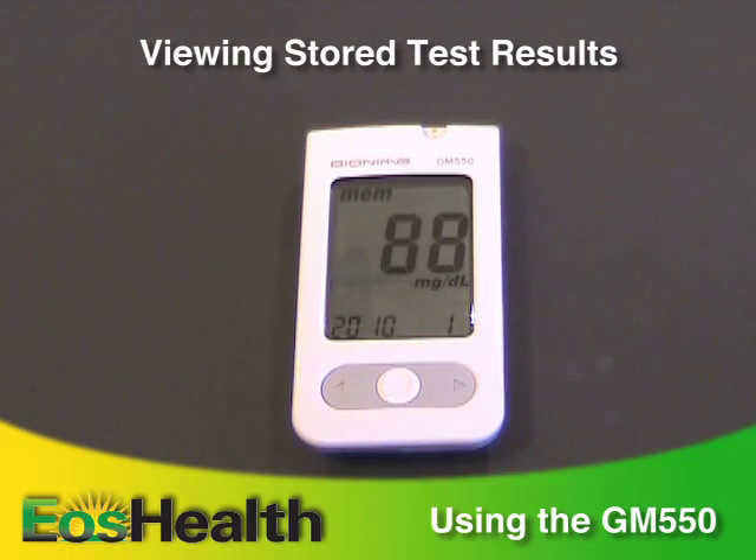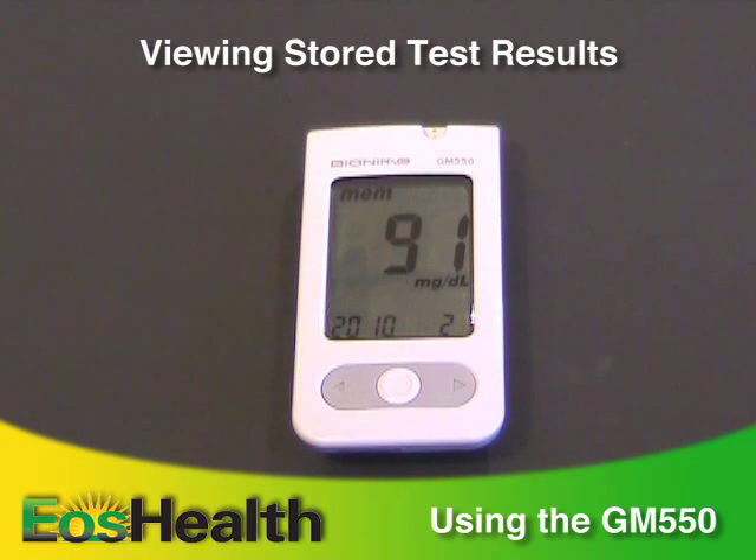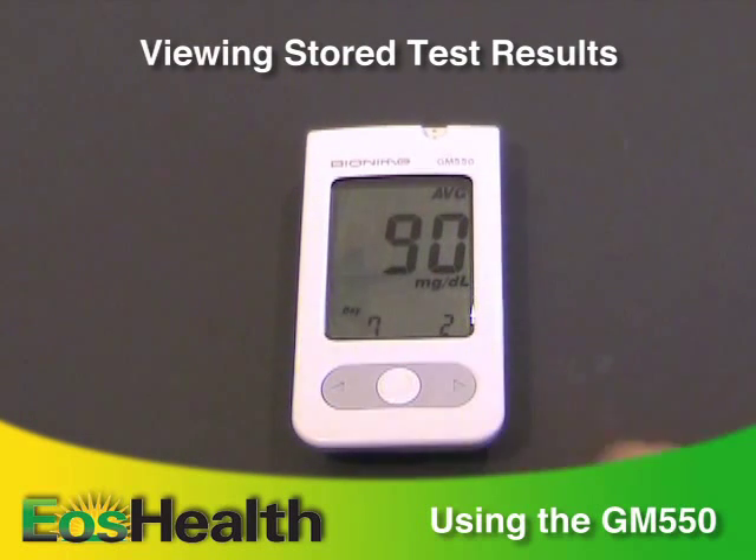Press the main button to switch to the memory mode. Press the right arrow button to view specific readings. Press the main button again to view the averages of your readings over the past 7, 30, or 90 days.